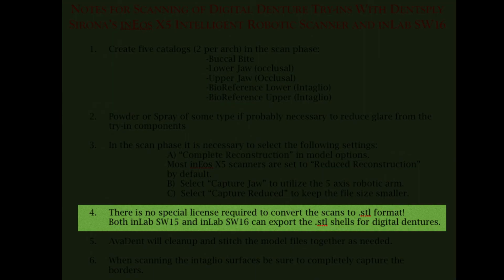4, there is no special license required to convert the STL scans. Both InLab 15 and 16 have the ability to export STL shells.